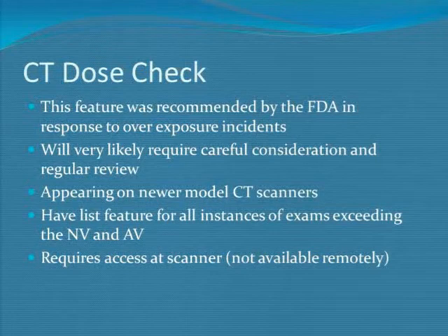Everybody has this very specific ID number at our place. And then we have some specific phrases that we're trying to get them to use so that we don't see 120 different ways of saying the same thing, which we often get. And right now, our rationale, our reasons that we can think of ahead of time are large patient, metal in the field, and oddball position, although it doesn't say that. It says something about patient position not standard, because we're trying to think of ways where the scout view might think the patient is really thick or highly attenuating.